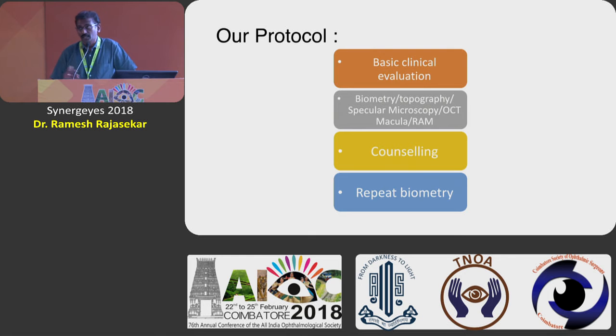And counseling, again, this is a major part. We do need to spend a lot of time. And then once a patient chooses a multifocal, what we do in our center is we repeat the biometry on another day to get to an undisturbed tear film. That is more important. So we need to have a spot-on biometry.